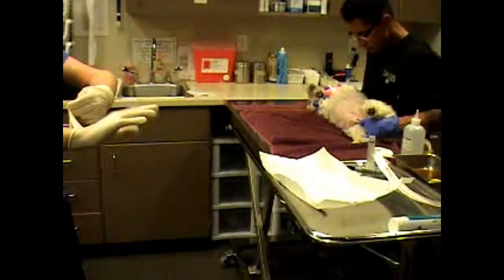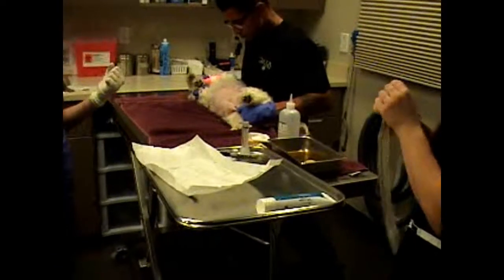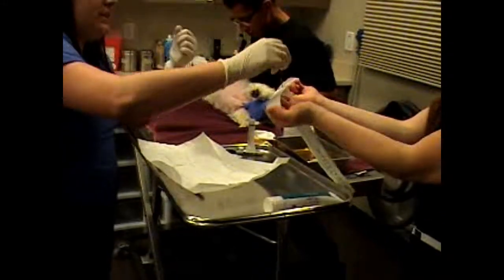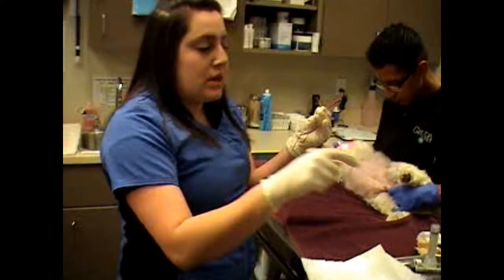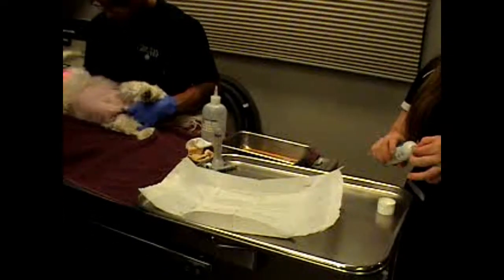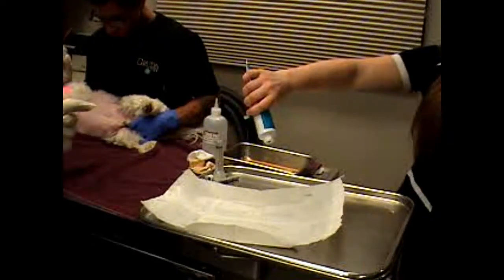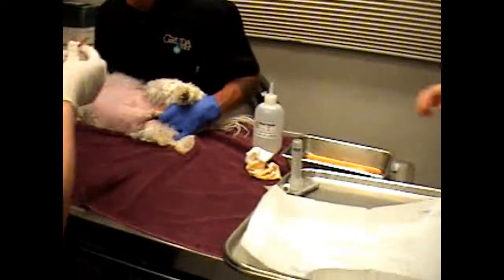Okay, Rachel, will you just go ahead and open that urinary catheter sterilely for me? And I'll grab that from you. Perfect, thank you. Okay, now if you'll just open that new tube of lubrication and just do a little dollop right in the center of that. So she's taking that seal off just because we want to make sure this is completely sterile. So just a little dollop. Perfect. And then what you'll want to do is just open that syringe sterilely and just drop it right in the center of that area as well.